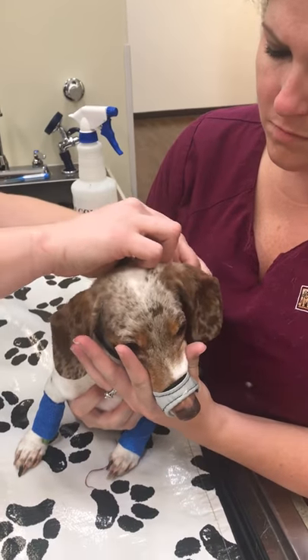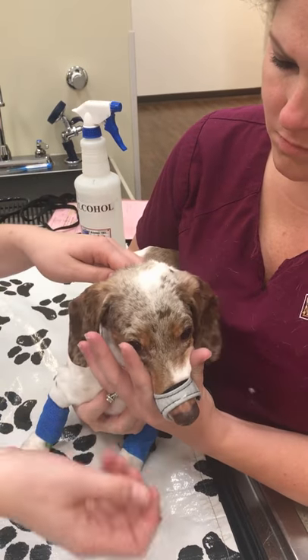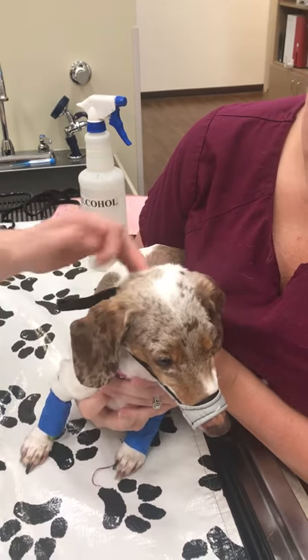Then you're going to clasp it in place and pull it nice and snug, making sure to cause no discomfort, and also making sure that the patient cannot open their mouth. And that's it.